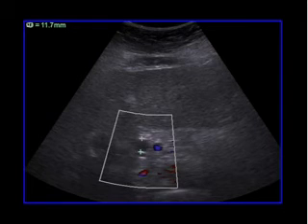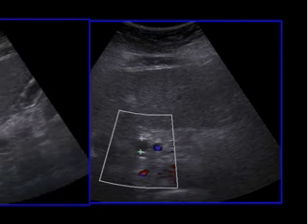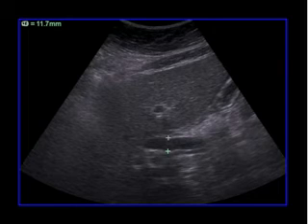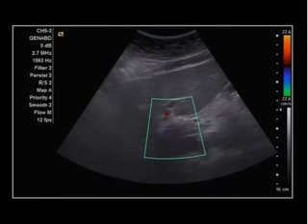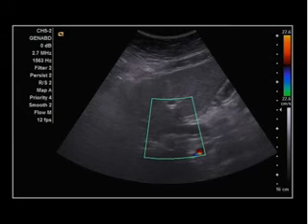Let's give you another example of this. This is another still image with a CBD layering just next to the patient's portal vein. If we then turn this into longitudinal, we see a markedly dilated common bile duct, which on this video does not show any color flow. This is a patient who had choledocholithiasis.